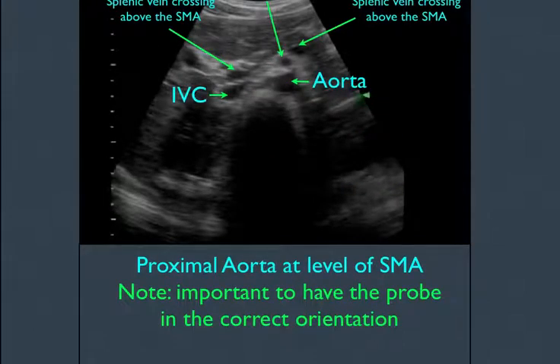So, we know that the aorta sits right on top of the spine. On the left side is the aorta, on the right side is the IVC. Makes sense anatomically because the heart is on the left side, and gives rise to the aorta. The IVC is on the right as it moves up.